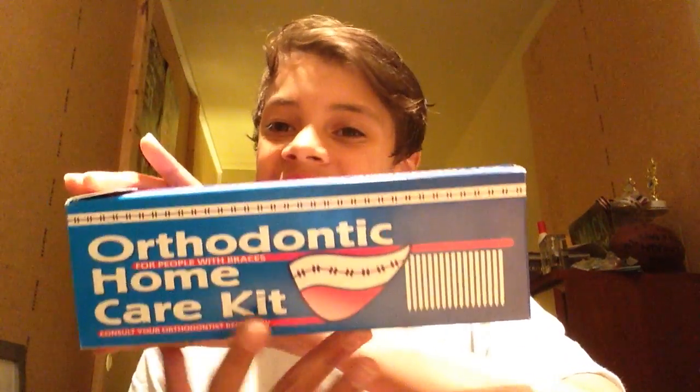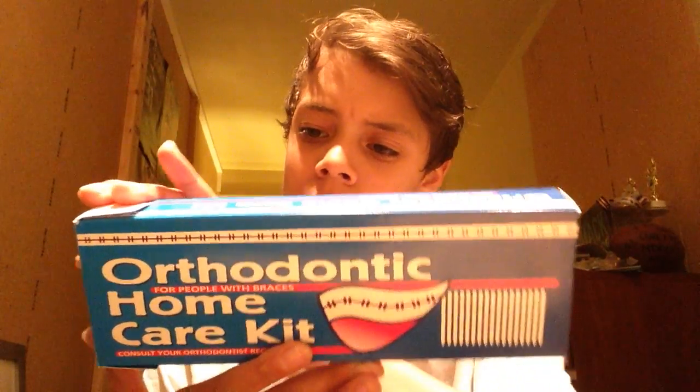Hey guys, I got back and my teeth don't hurt — they hurt a lot. Like, ow. So, this is an update video. After you're done getting your braces, they will give you this orthodontic home care kit. It's kind of a review slash package open slash update.